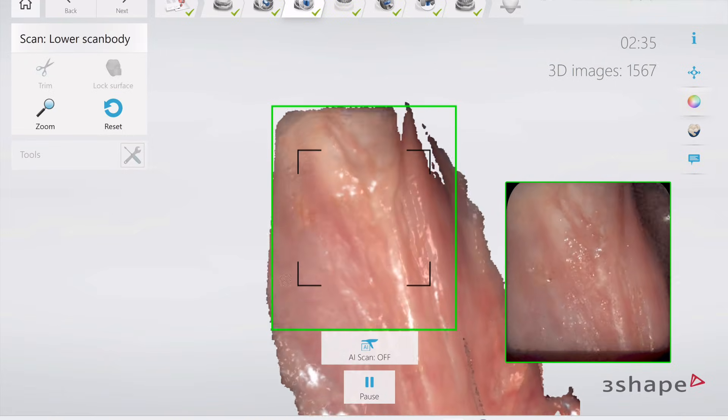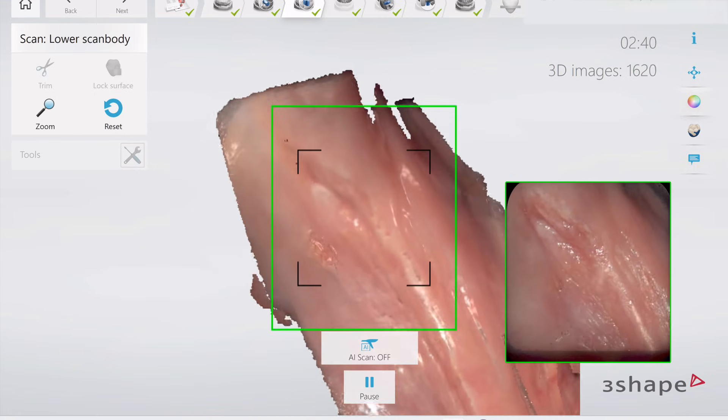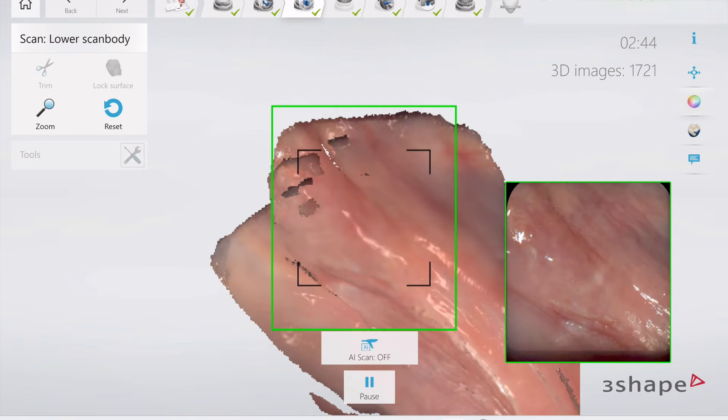And this is difficult. You're talking about doing one of the hardest things, maybe besides a bloody open suture or bone scan for an all-on-X prosthetic. This is the next hardest thing right here.